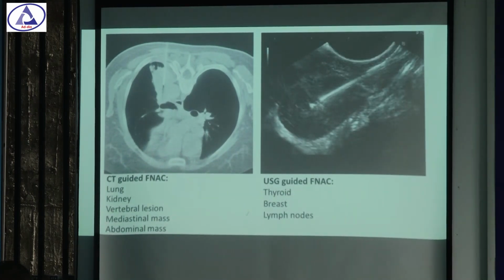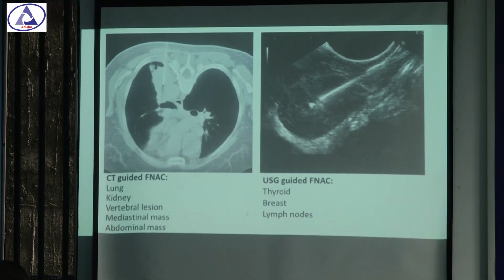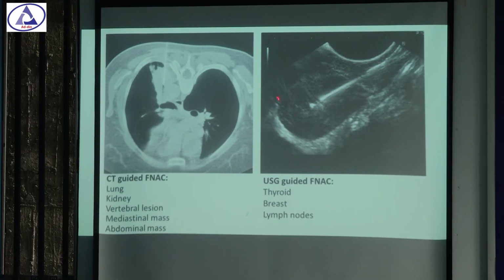And also USG guided FNAC can be done for lesions such as thyroid, breast, lymph nodes, which are not easily palpable or which are very deep seated. As you can see here, the needle is being inserted into the lesion.